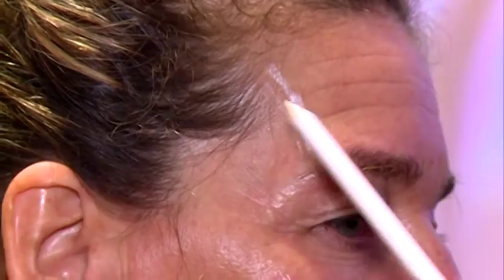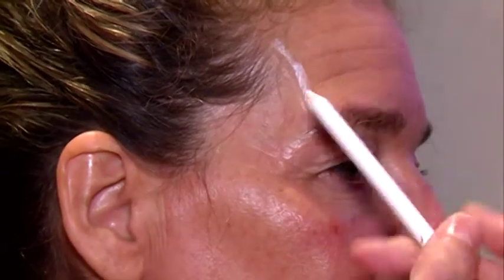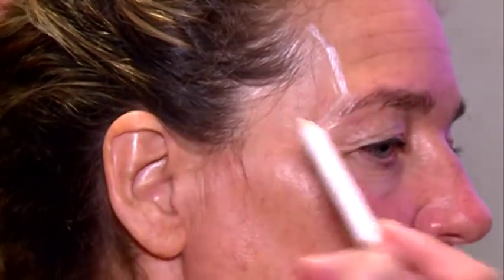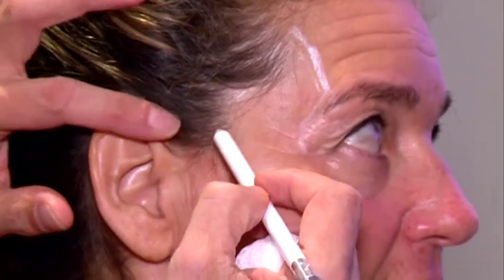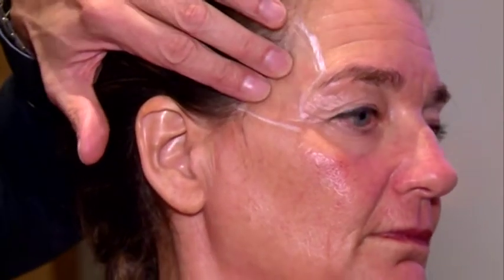So this is my border superiorly to the forehead. And then we have the anterior border, which is the orbital rim, roughly here. And then we have the zygomatic arch with the inferior border. There is no border backwards. What is the structure we have to take into consideration? This is the superficial temporal artery. We have two arteries, the superficial and the deep ones, but it's more the superficial artery. You can sometimes palpate it if the patient has high blood pressure, but in her case she's very relaxed, so I think she trusts me.